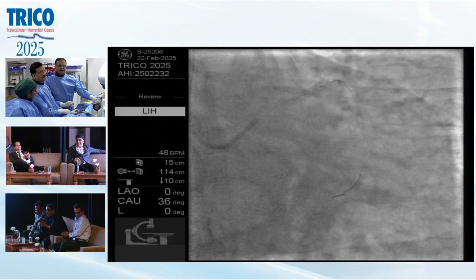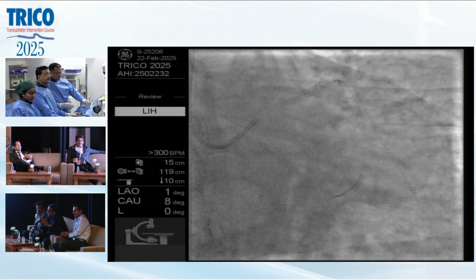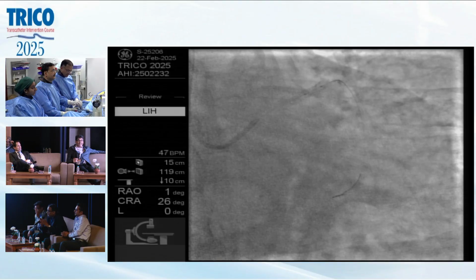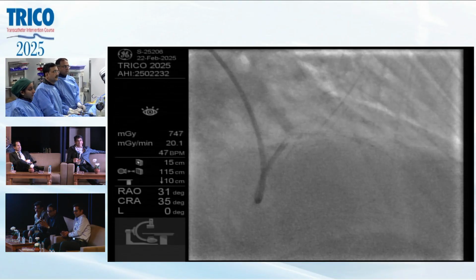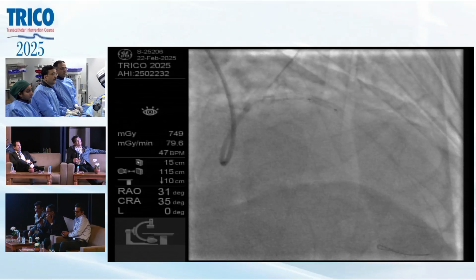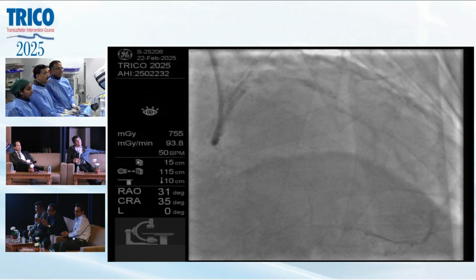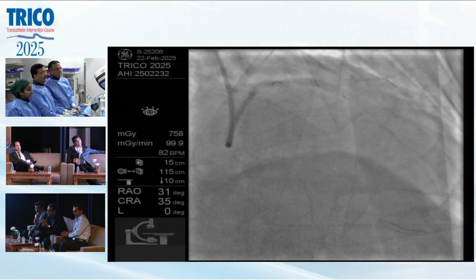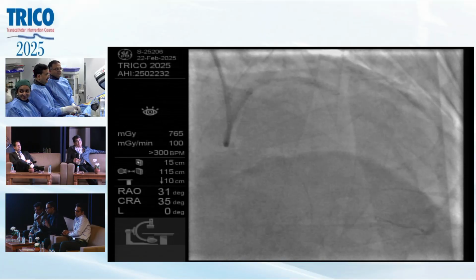So we do. A stent failure is actually an opportunity to try and get the best kind of result that the patient can have in the long term. Any information that we get from imaging, angiogram, stent enhancement, everything is going to help us. And we would prepare far, far more than this, and maybe do another OCT run at the end before finally putting the stent. It's just a difference in approach, in philosophy.